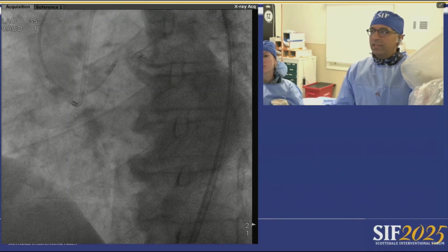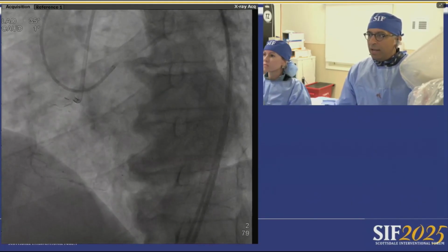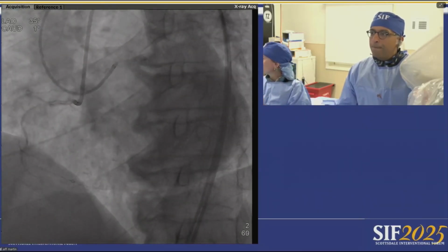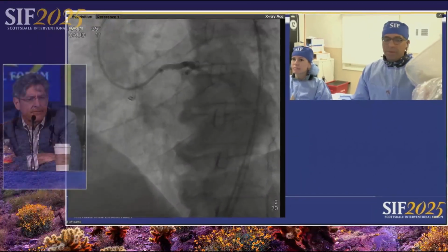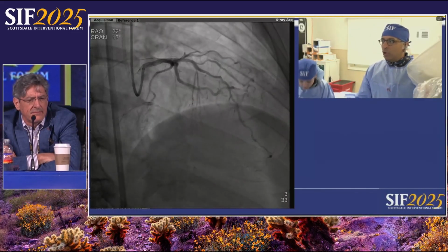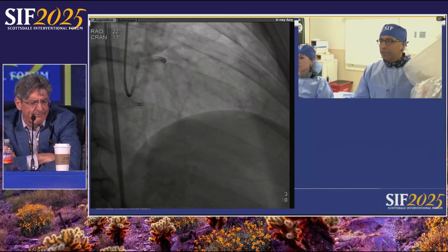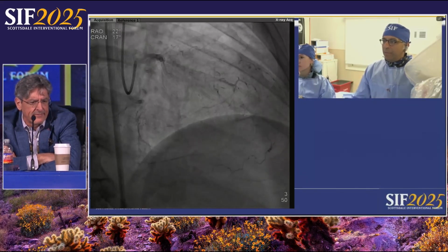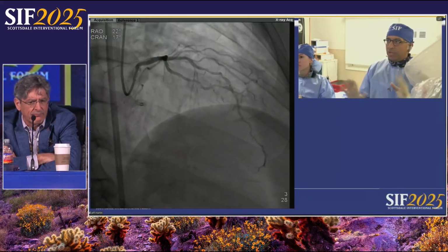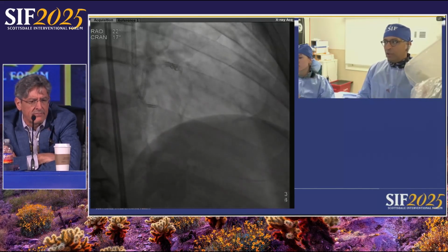Move to the next slide, next image here. Is the image projection pretty good? Are you guys able to see reasonably well? We're seeing your dual injections at this point. Okay. And so this is the dual injection, and then this is the cranial setup shot looking at the epicardials, I mean, the septal collaterals and the left atrial collaterals from the left atrial branch to the PLB. And I'll stop here and ask the group how they would approach this, and then I'll tell you what we've done so far.